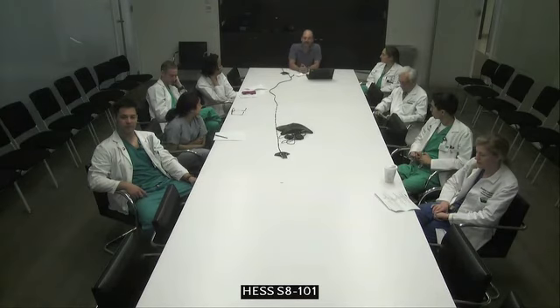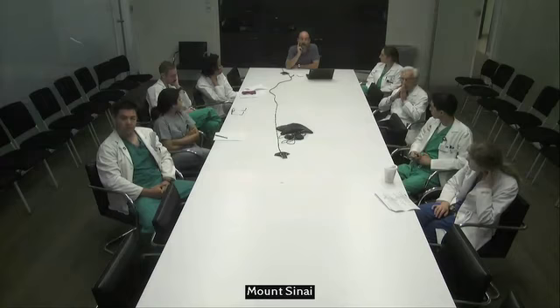I think that, when we talk about a lot of the differences with robotic surgery, you hear about the better visualization. If you like 3D visualization, you can get that same visualization by buying a 3D laparoscope to use with straight laparoscopy. If you feel that you're getting better function in small spaces, I really think that a lot of these advantages which are touted are somewhat imaginary. Certainly in terms of the ergonomic advantages, I think that you're trading off one set of difficult ergonomics for a different set of difficult ergonomics because you're sitting at a console which, frankly, after sitting at it for 3 or 4 hours can get pretty darn uncomfortable.